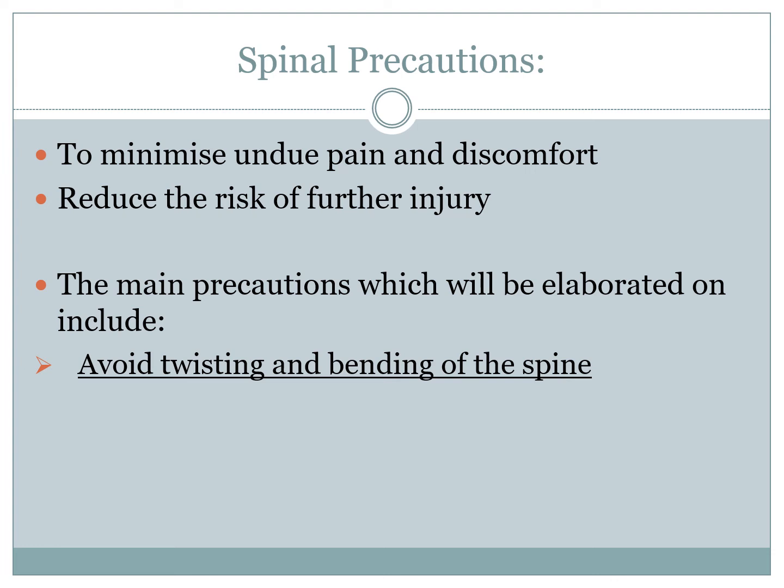No matter what spinal brace has been provided or what wearing regime has been advised, it is important that all patients adhere to spinal precautions. Spinal precautions are basically the do's and don'ts. These precautions involve what movements to avoid and how to modify your activities of daily living to best accommodate them. It is extremely important to adhere to spinal precautions in order to minimize pain and discomfort and to reduce the risk of further injury.